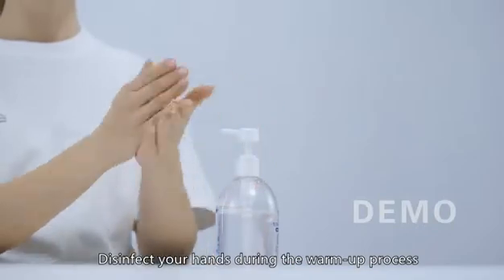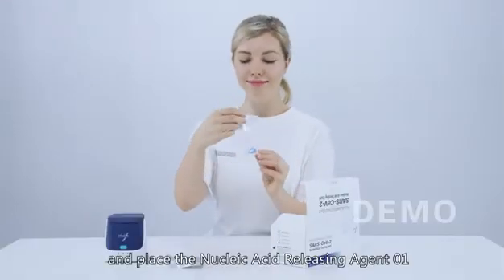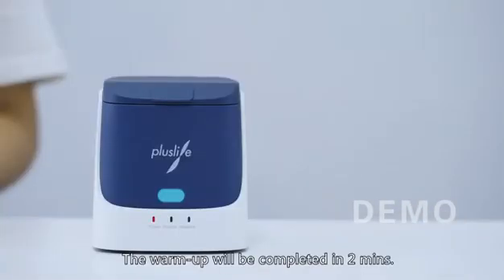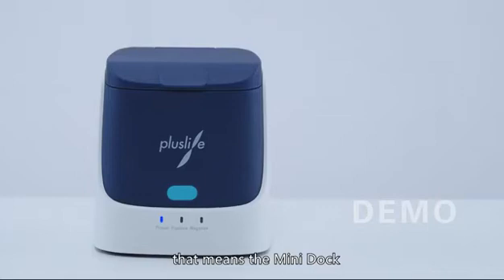Disinfect your hands during the warm-up process and place the nucleic acid releasing agent 01 on the cart holder. The warm-up will be completed in 2 minutes. After the power light turns from flashing red to blue, the mini dock has finished warm-up and is ready for the test.